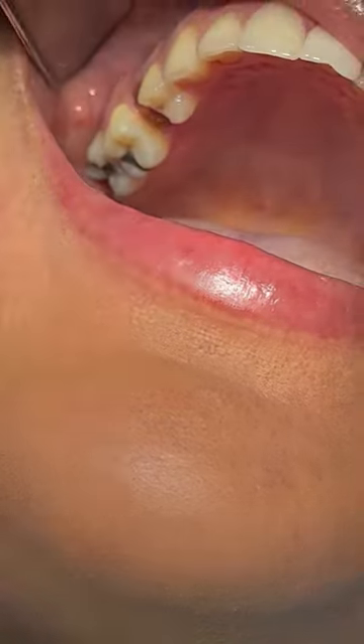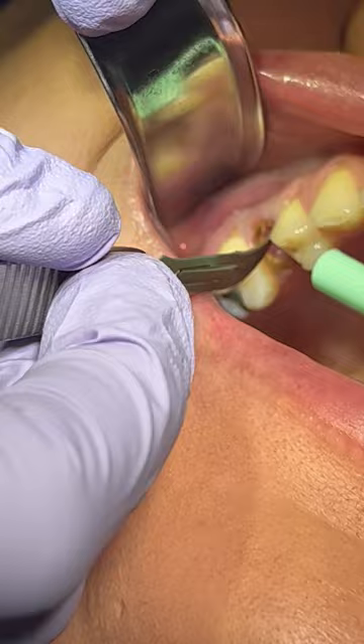Thank you guys for joining us on Tooth Be Toed case presentation. This is the case for tooth number four to be extracted and implant placed at the same time.